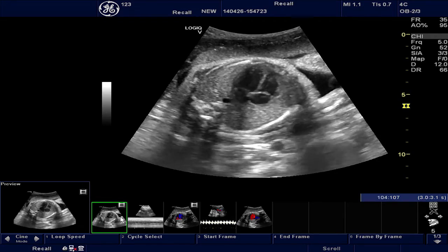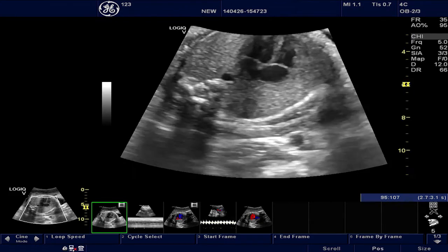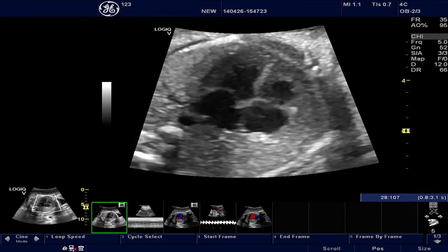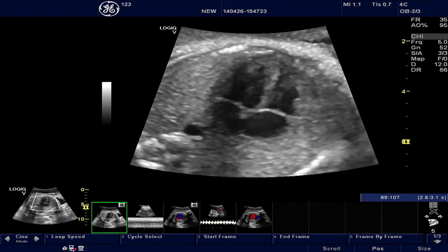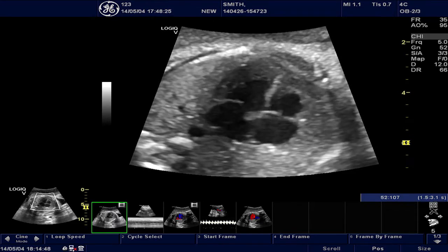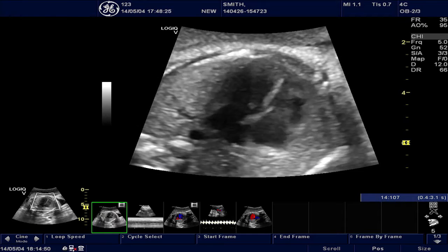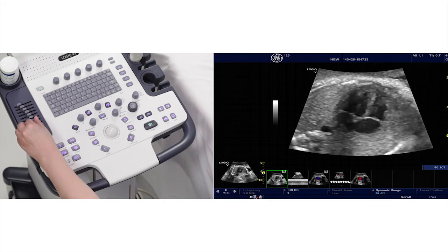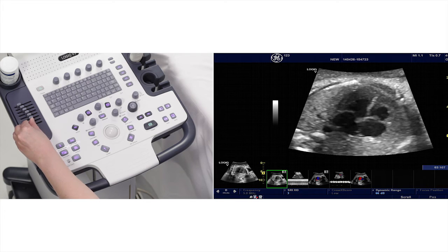Resize your acquired image by using the zoom function. You can adjust the image by using various imaging controls. You can use the active mode key to access B-Mode controls on the top menu.